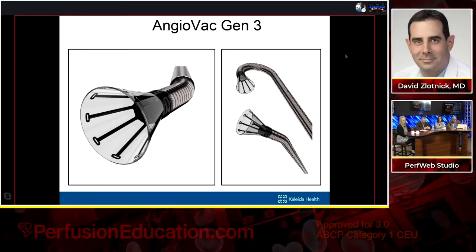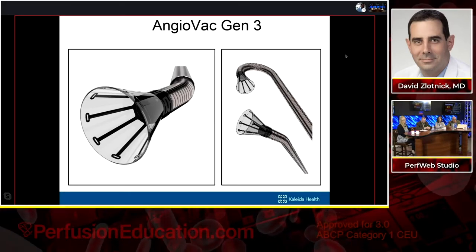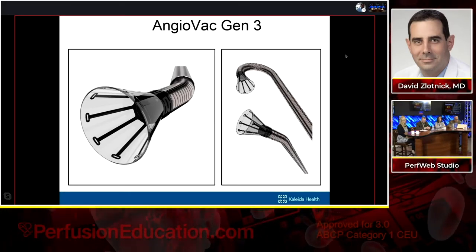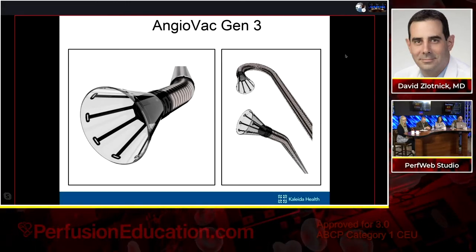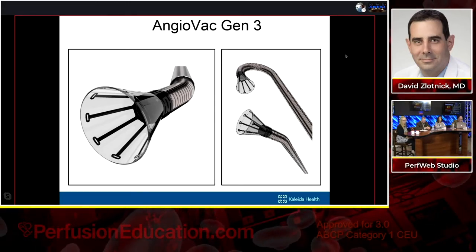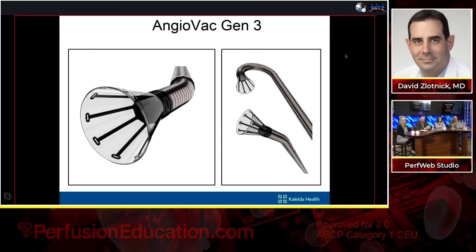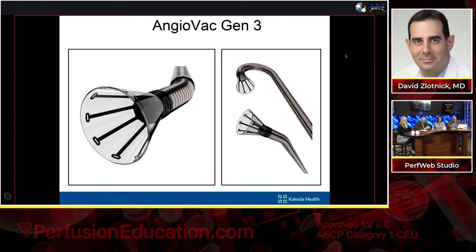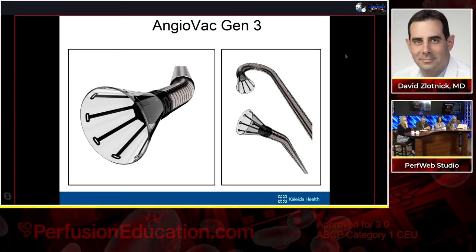And as it comes out through the sheath, we can actually control the amount of bend that the cannula makes, anywhere from around 60 all the way to 180 degrees. And unfortunately, I think this next slide is going to have both video images as well as just still frame fluoroscopic images of the C180 cannula. This was a tricuspid endocarditis case that we recently did in this patient.